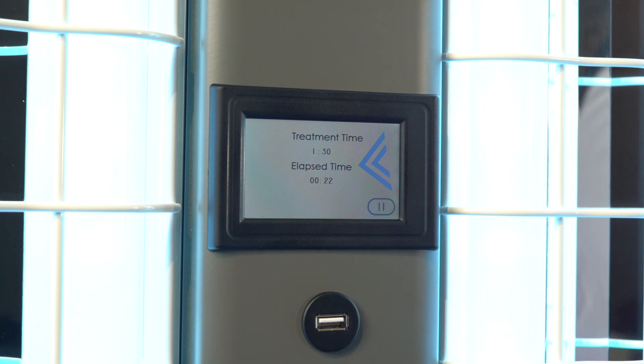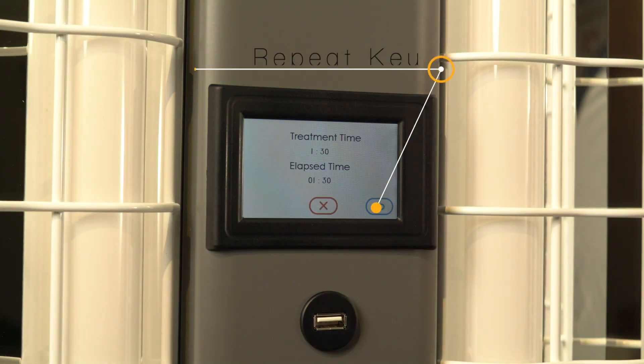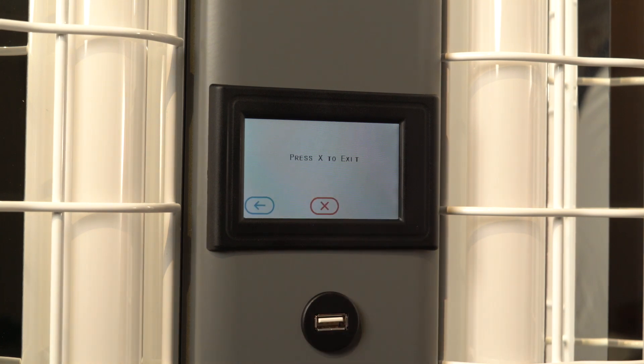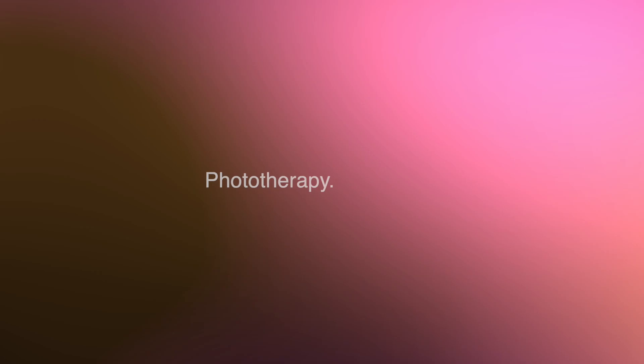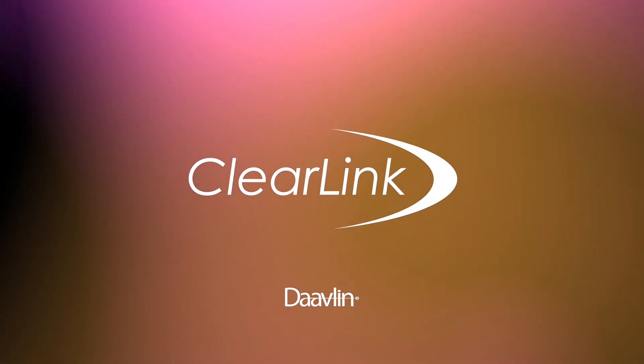Once the time that you entered has elapsed, the lamps will shut off, the screen will display your delivered treatment time, and the system will record that information plus the date and time of the treatment in its record. If it is necessary to treat several areas of your body—what is called a treatment sequence—simply press the repeat key after each segment of the treatment, and the exact time will be repeated up to three times. After your treatment has finished, press the red X button and the device will go into its sleep mode. Congratulations, you have successfully completed a treatment with the Daavlin ClearLink controller.